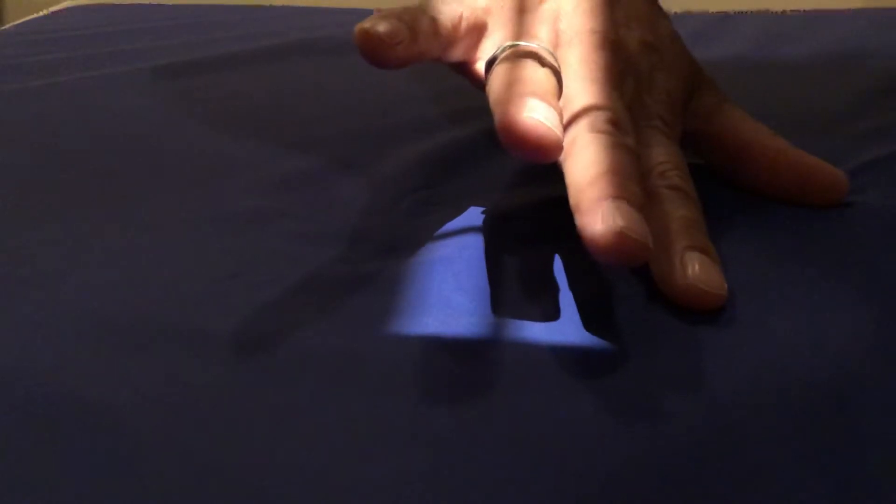The lateral for this is going to be a little tricky because this doesn't have any tendons back here to hold the fourth finger back. So you can take a pen — what you're going to do is make a fist with the other fingers, and then with a pen or some other object, you're just going to push this one back as far as it can go. Have them do it, obviously, and then you take the x-ray right here.